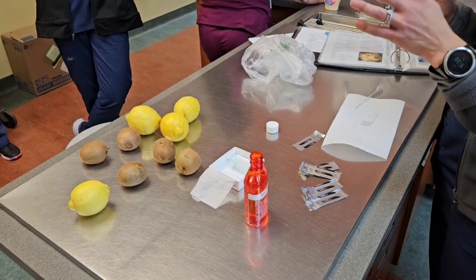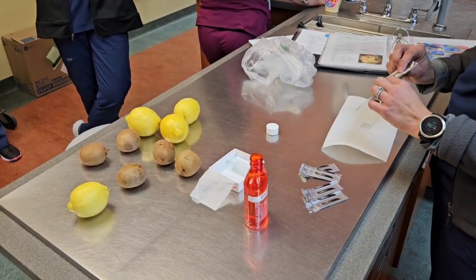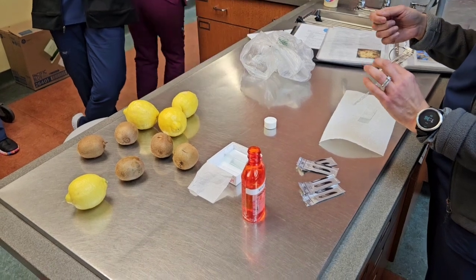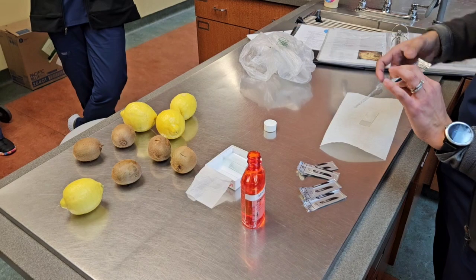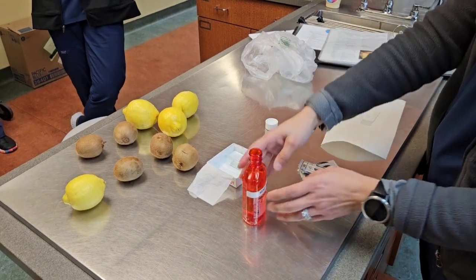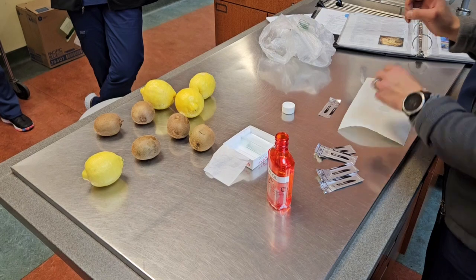So the supplies you need are a ten blade. The rounded one is a little easier to scrape on a pet that may have a not flat surface that you're scraping, like a contoured belly or something. A slide, mineral oil, and that's it.